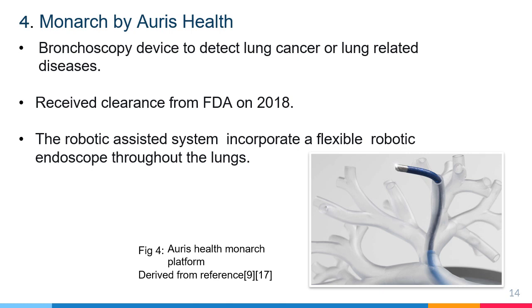It is more difficult to perform than the widely used ureteroscopic method, which sends a scope through the urethra and bladder to reach the stone. With Monarch's help, however, surgeons can use a video game-like controller to send the endoscope safely through the skin to the kidneys and remove broken-up kidney stones and any additional fragments with greater precision. The system can also be used in ureteroscopic procedures to remove smaller stones.